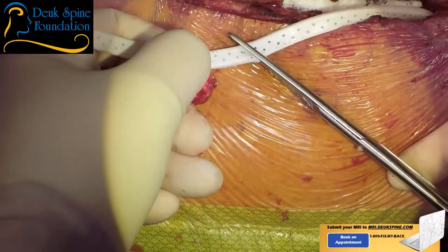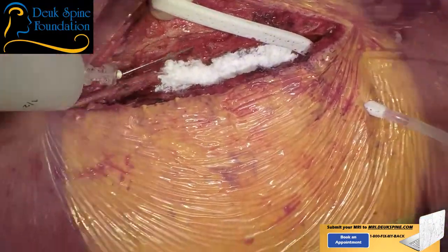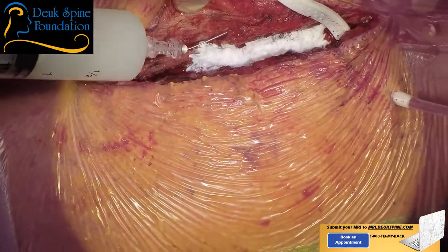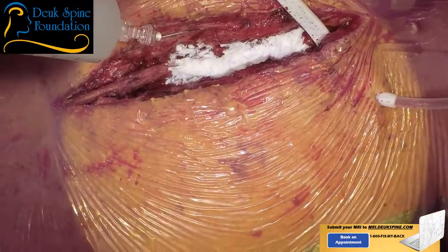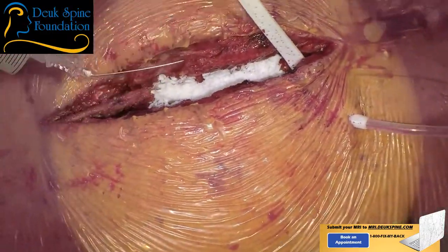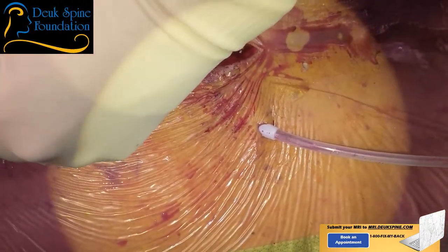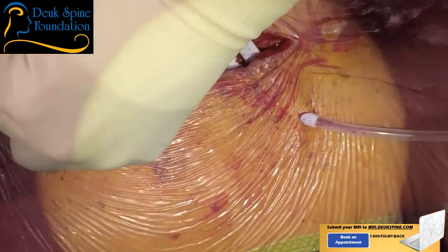We're going to use a drain because it's a little more sanguineous than I'm happy with, and right over the spinal cord. Just be careful with that needle. All right, you got sutures? Yeah. We'll be closed in about 15 minutes. Okay. 15, 1-5.